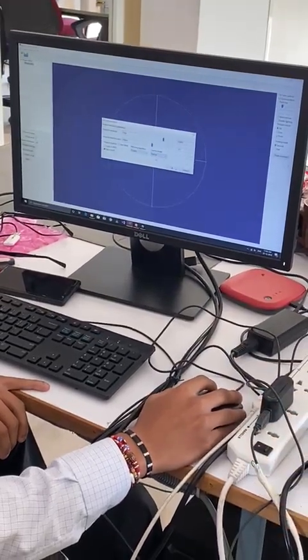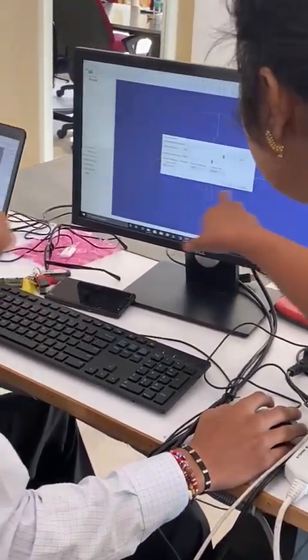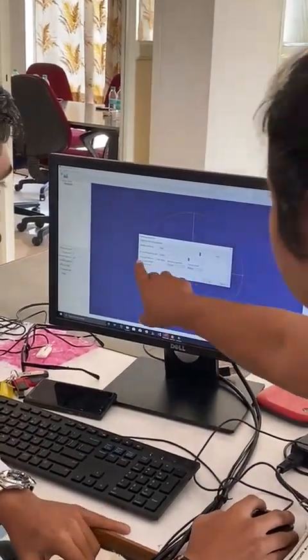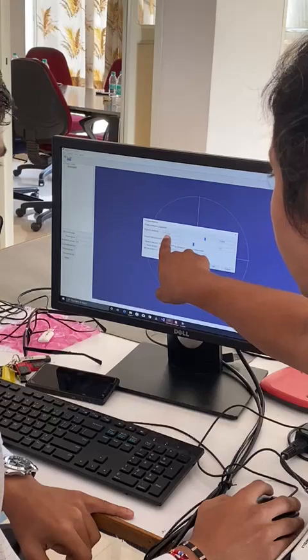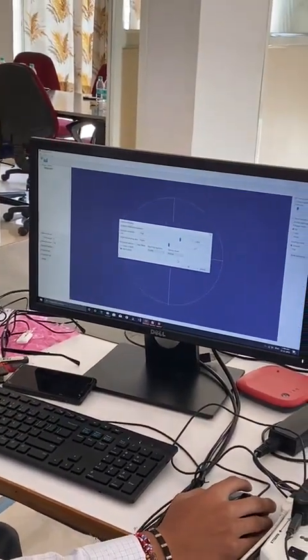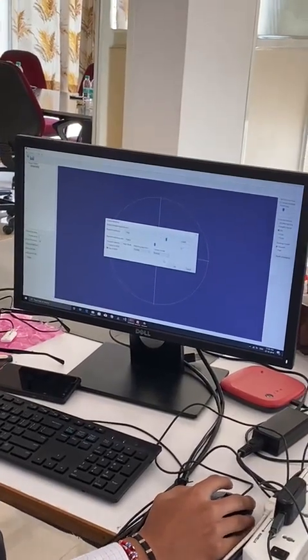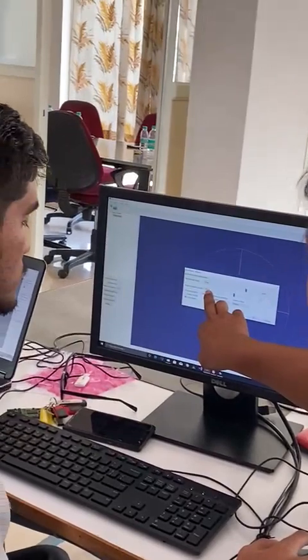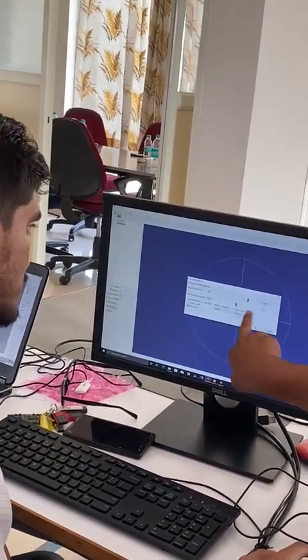What we have done. Explain what you're doing. Okay. So this particular section, whatever we are doing, is matching. So here we have key point sensitivity. Since the focal length is very low over here, I need to keep it at a very high level in order to at least get the matches for the end to end, the complete arch. And over here, what is the ratio? I have set it to 0.7.